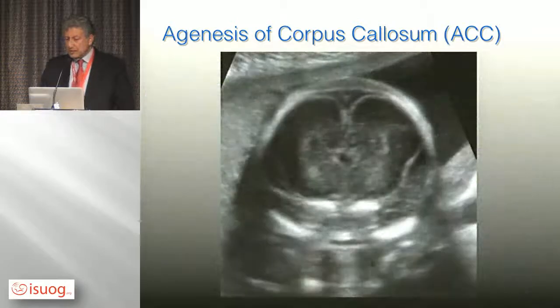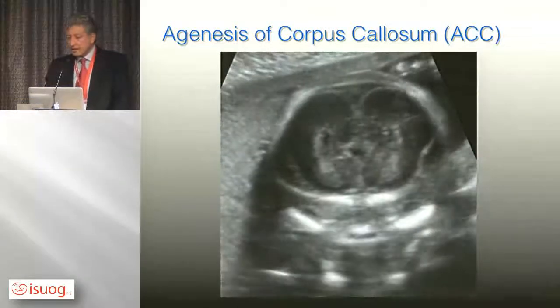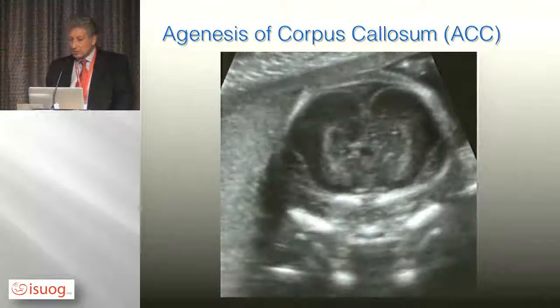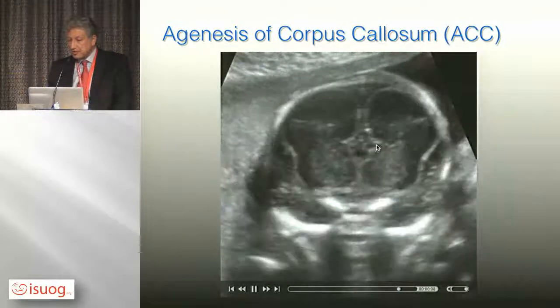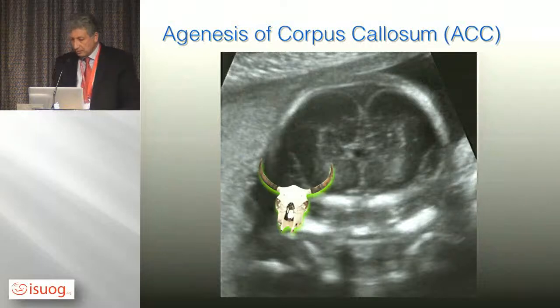I don't show you the best example of transvaginal, but I show you the transabdominal scan. Once you rotate the transducer to get a coronal view, you see that you don't have this T, you have rather this image of the steer-horn, which is well recognizable.